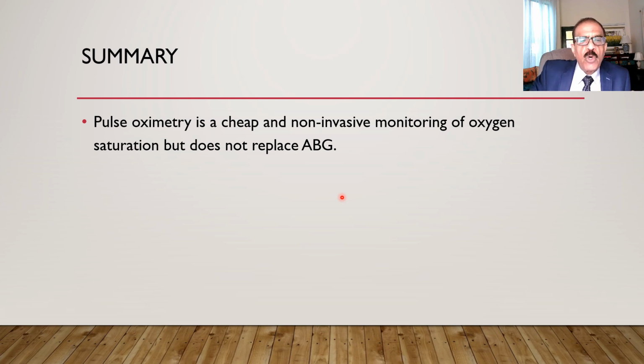It does not measure actual ventilation, because it doesn't sense carbon dioxide. It can also overestimate hemoglobin saturated with oxygen when there is methemoglobinemia or carbon monoxide poisoning. Keeping all these limitations in mind, it is still a great tool because it is non-invasive, cheap, and what we are mostly interested in is the change over the baseline. For that, it is great.